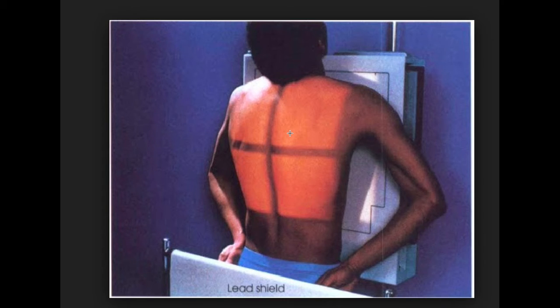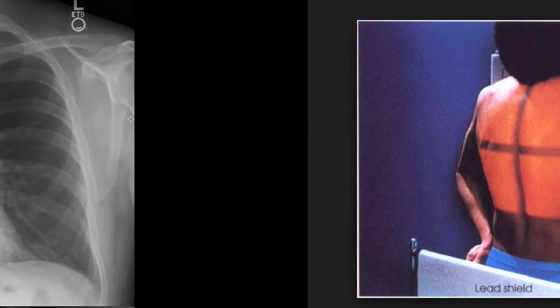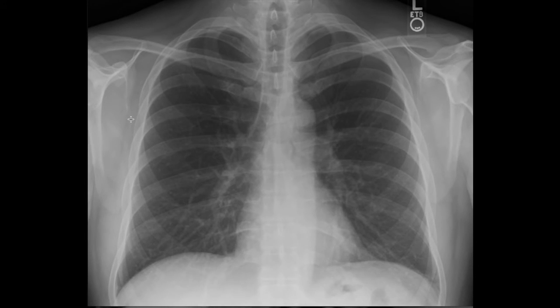This is actually the universal view, or let's say the basic view for a chest X-ray, because it has many advantages. Now, first of all, is the heart. In a PA chest X-ray, the heart comes within the normal size usually. It is not distorted. It shows what the heart size actually is.